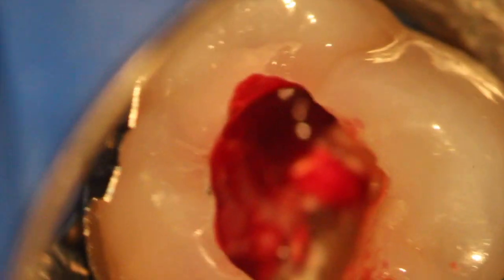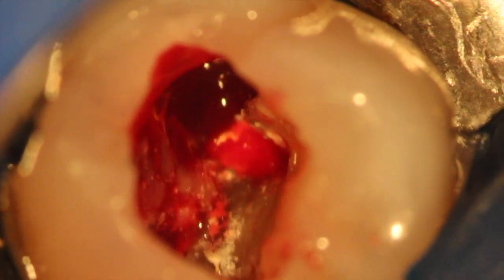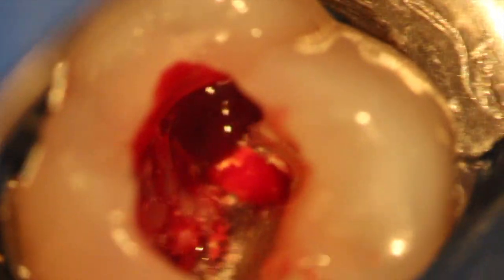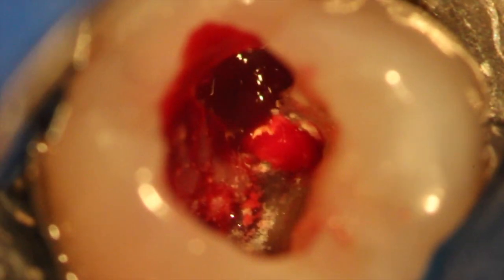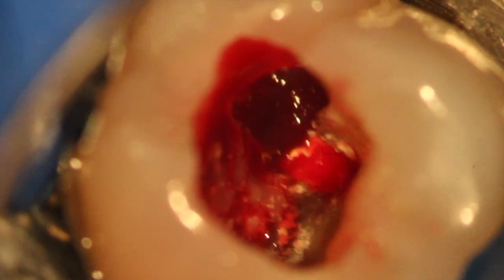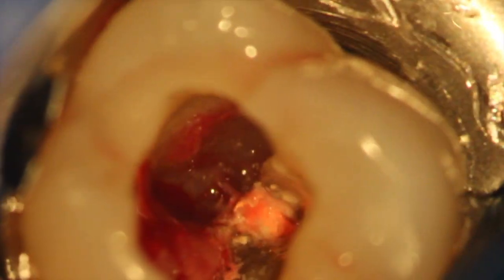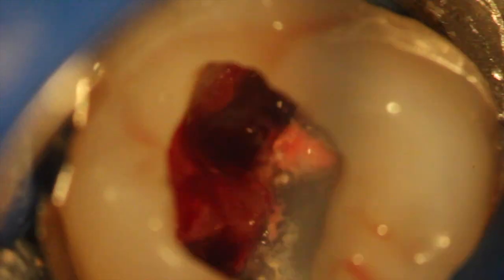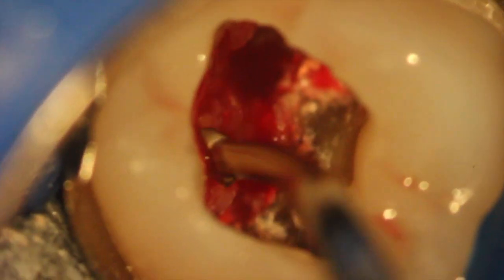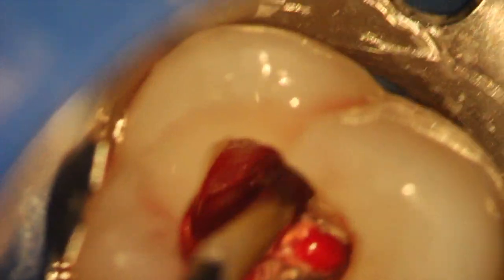So we took photographs, x-rays, videos, 3D imaging, and went in through the microscope to do the job. You can see what's still there that needs to be curetted out. As we look down, the bleeding has stopped. There's some tooth structure there, and the more apical extent and the more palatal — really the distopalatal extent — and I'm just doing some more curettage.